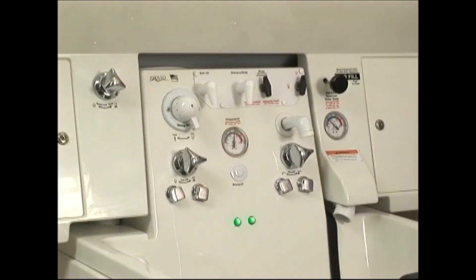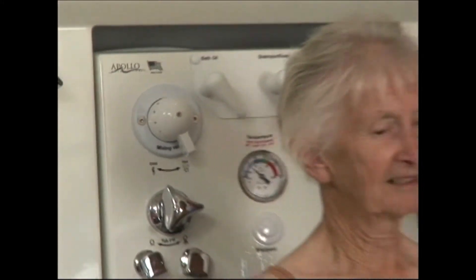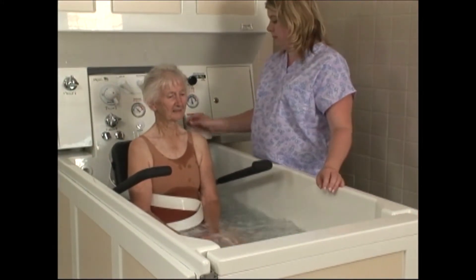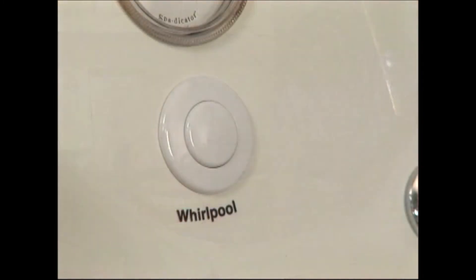When the whirlpool jets are activated, two green lights located on the control panel will turn on, indicating that the Remedy UV system is running. Dispense bath oil into your hand and swirl it into the tub, then repeat the process with the soap and shampoo.